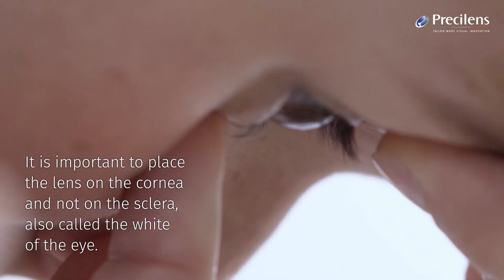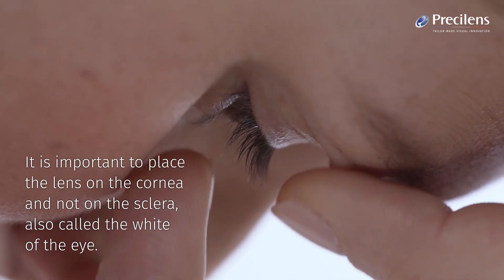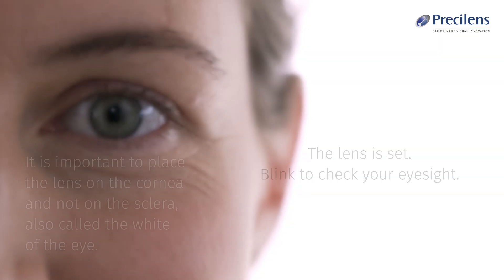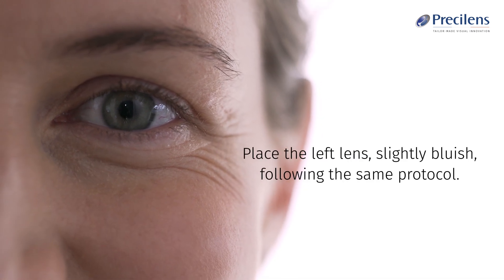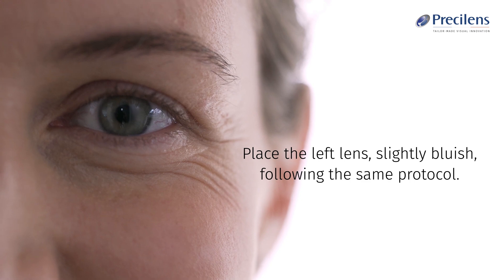It is important to place the lens on the cornea and not on the sclera, also called the white of the eye. The lens is set. Blink to check your eyesight. Place the left lens, slightly bluish, following the same protocol.